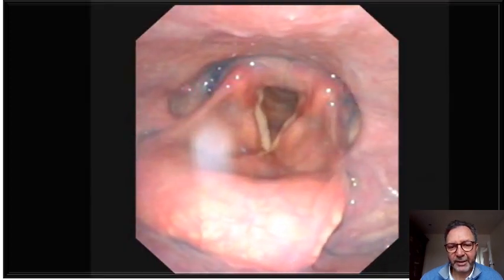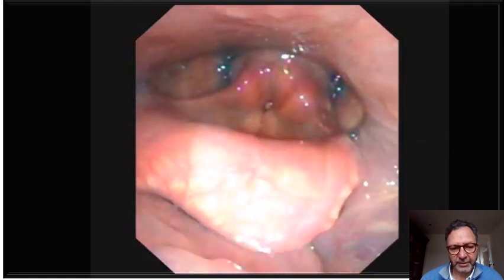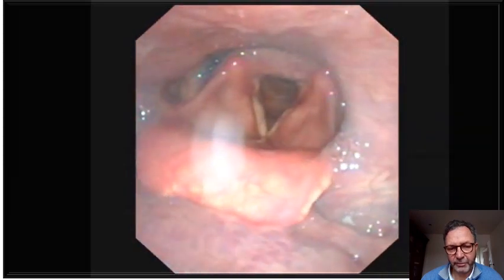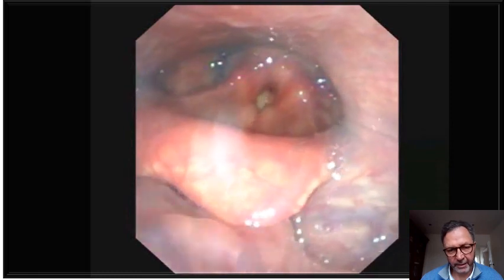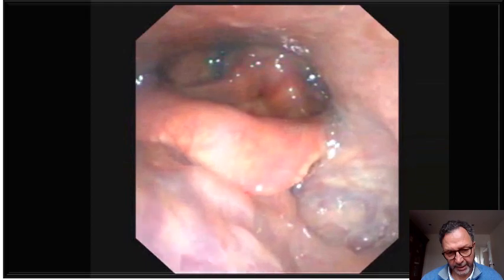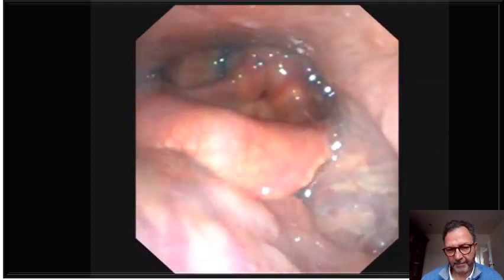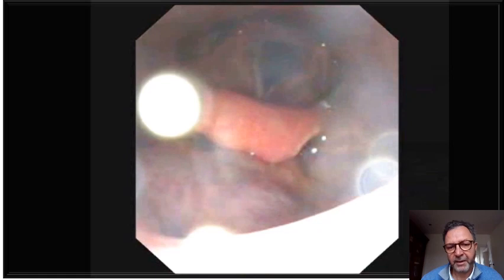So you can test that again during challenge 4 if you're not sure. You ask the patient again to keep it in the mouth, and then you see here the base of tongue dancing with aborted motion before being followed by an effective pharyngeal swallow. Here you see the same. You see this aborted motion here. This is clearly a lingual dyspraxia. So if you're not sure at challenge 2, you can repeat exactly the same challenge during challenge 4 and check if your first idea was right.